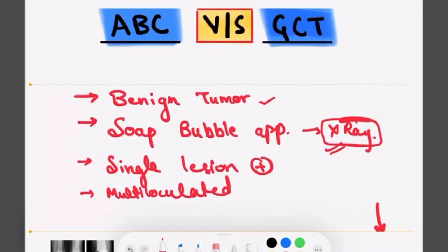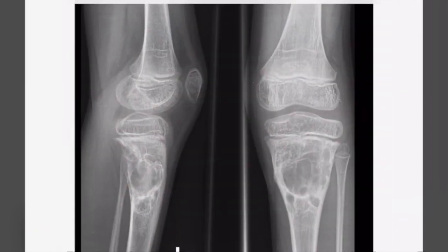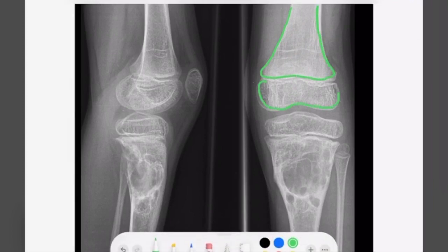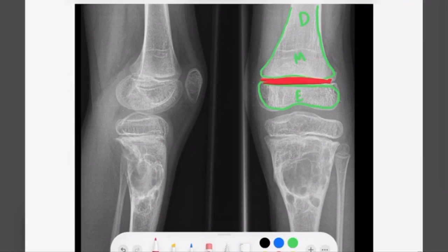Now let us begin with the differences. This is an X-ray of a knee which is showing the epiphysis, the metaphysis, and the diaphysis. We have the physis between them.